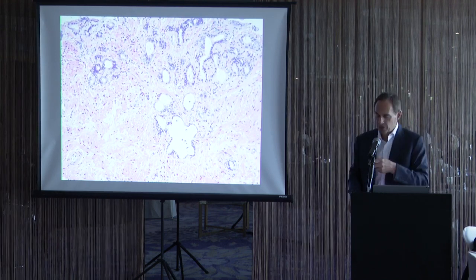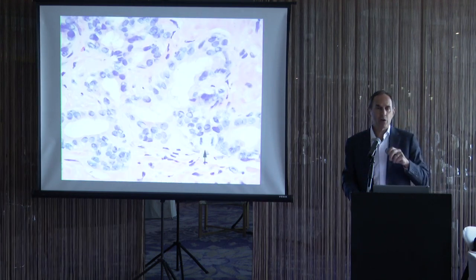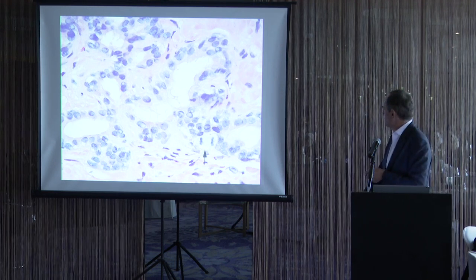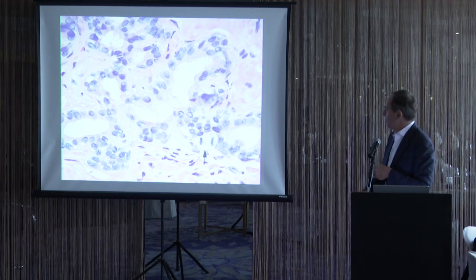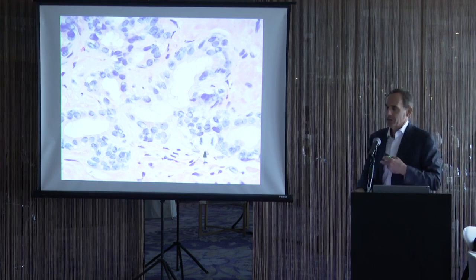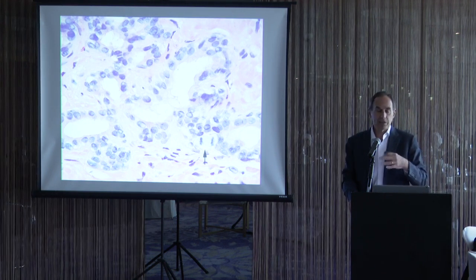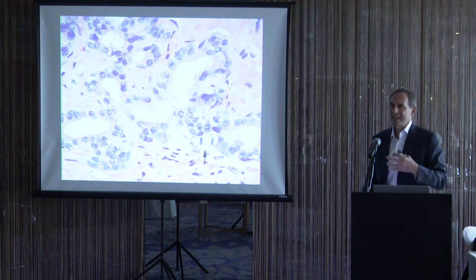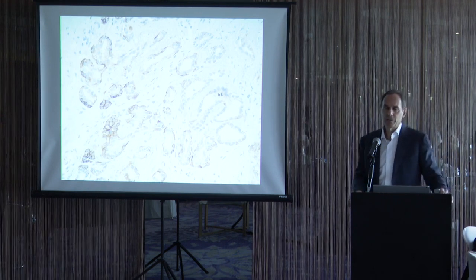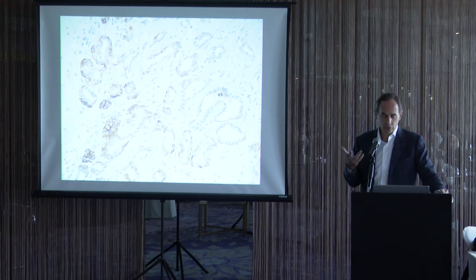If you see blue glands, nice well-formed lumina, that's atrophy. If you go to higher power with atrophy, you can actually get confused because atrophy can sometimes have some small nucleoli, not the huge nucleoli that we saw with some atrophic cancer. And the word post-atrophic hyperplasia actually is accurate scientifically. Even though these glands are atrophic, they are actually proliferating. If you do a Ki-67, they're actually increased, and you can see mitotic figures in atrophy. The good thing about post-atrophic hyperplasia is that it tends to be diffusely positive for basal cell markers, high molecular weight cytokeratin or P63.